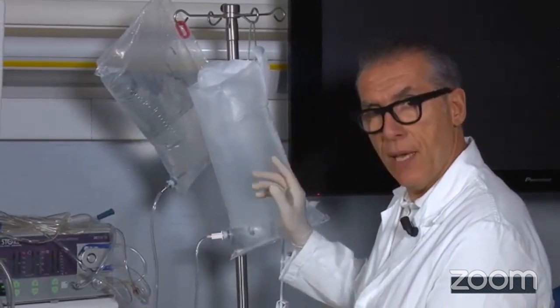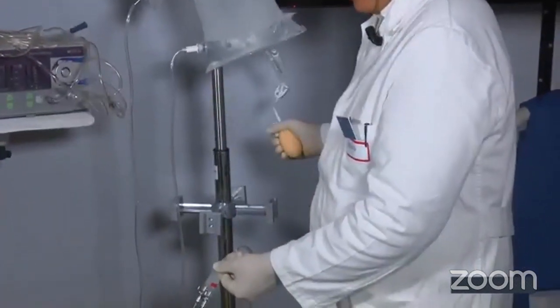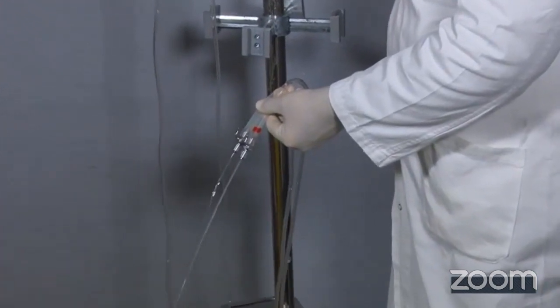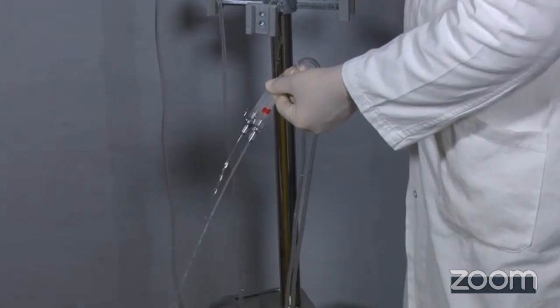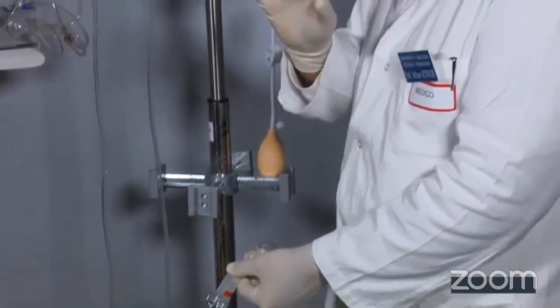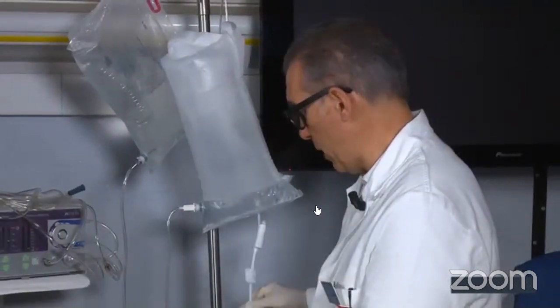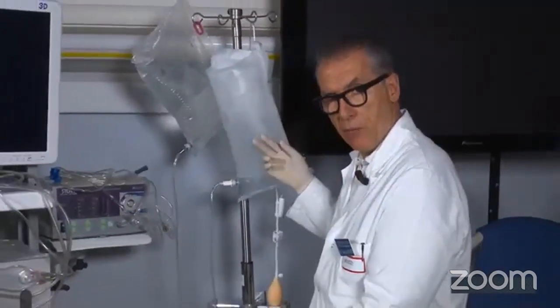If we use a compressive cuff, it's a variable pressure because, going back to the silicone tubes, I increase the pressure. As soon as I increase the pressure, the flow increases. This is the effect. So it's a totally manual control. There is no way to know how much pressure I'm generating inside the uterine cavity. We don't know the flow, therefore we don't know the pressure. And the pressure I'm applying on this instrument is nothing. It's just a pressure to compress the 5 liters bag inside.